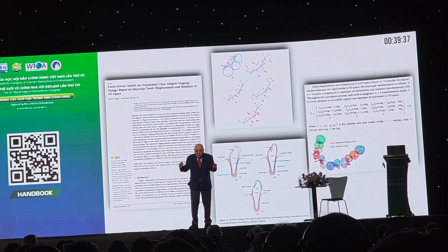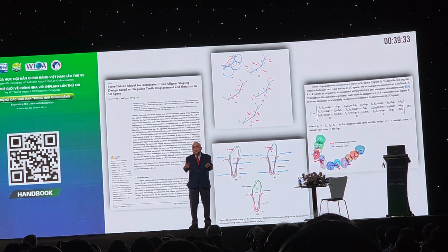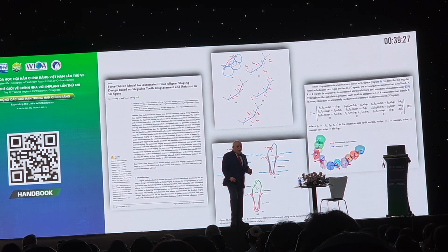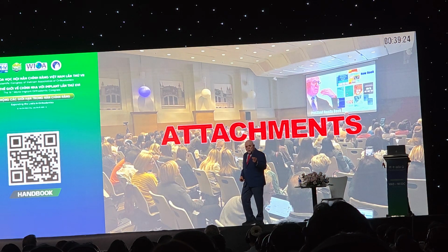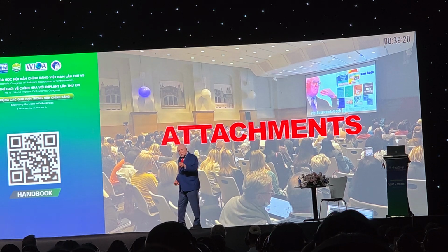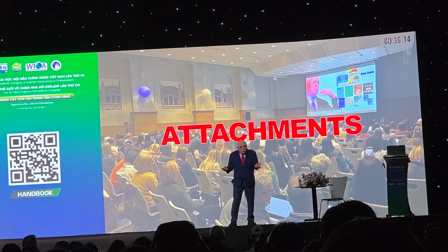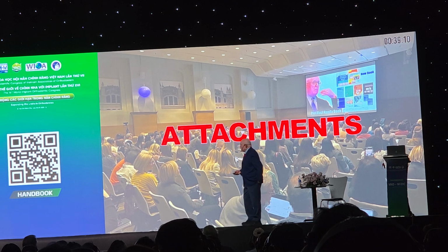Force is generated by adjacent teeth which are not going to move so that your tooth can move forward. That becomes very important. And what this study talks about is how technicians develop aligners based on your treatment plan. It also talks about why aligners don't work, because of the material and because of what the technicians are going to do.